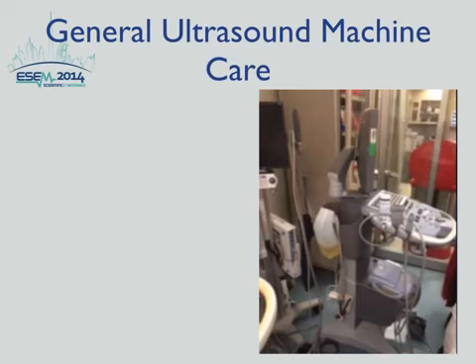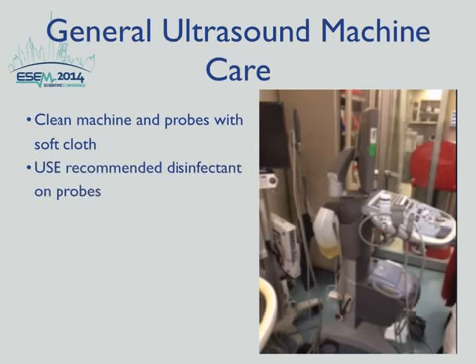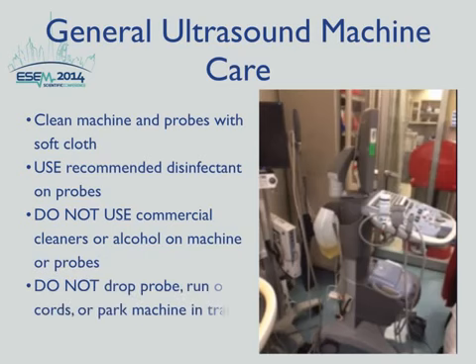So remember, these machines are expensive, so keep your machines clean. You can clean the machine and the probe with a soft cloth. You can use the recommended disinfectant on the probes. Do not use any commercial cleaners or alcohol on the machine or the probes. And do not drop the probes, run over the cords, or park the machine in traffic, because that's just going to ruin the ultrasound machine and therefore it will be out of service and you will not have this valuable technology with you.